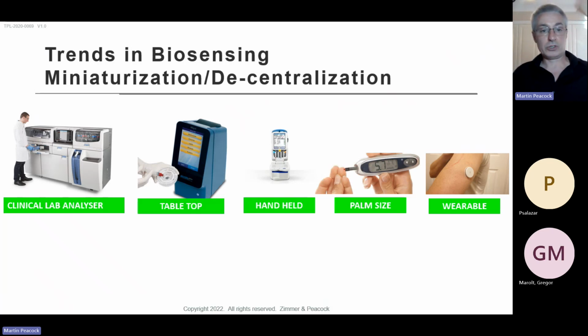So, to go from, in some ways, if you're doing an R&D project and you produce it like a glucose meter, you could argue that actually that was all very wearable. But of course, with Abbott, now they've shrunk this right down. I don't want to imply that Abbott's in any way a ZP product, but it is a good illustrator of essentially what's an electrochemical cell.